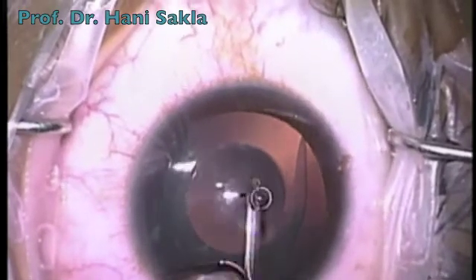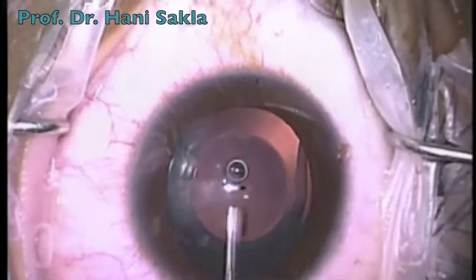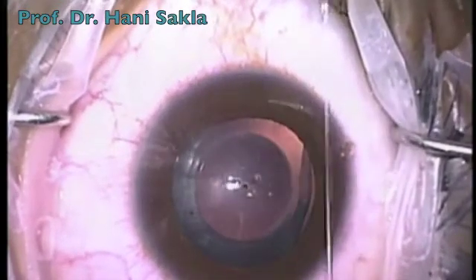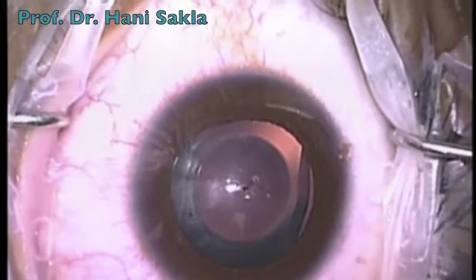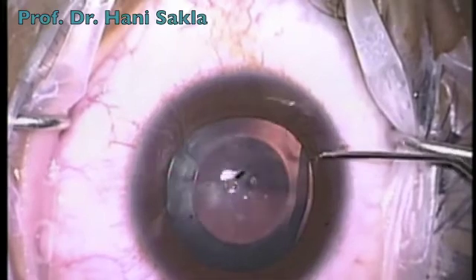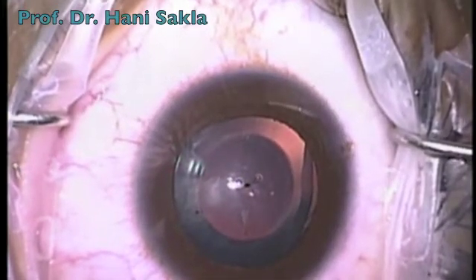Usually the lens is designed with its axis requiring only a very small rotation. In addition, we inject Miochol into the chamber to constrict the pupil and wash most of the viscoelastic out of the eye.